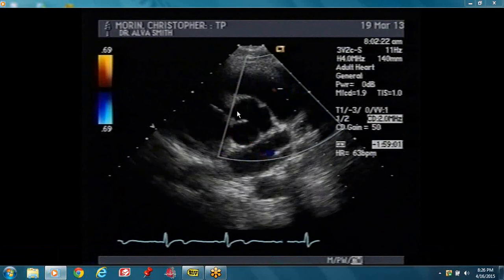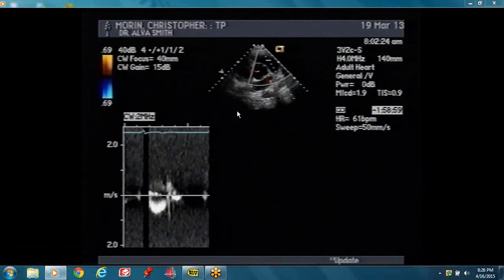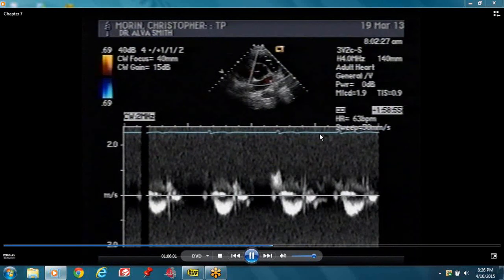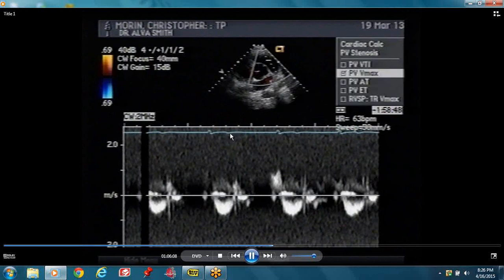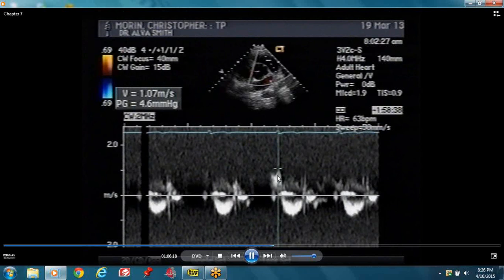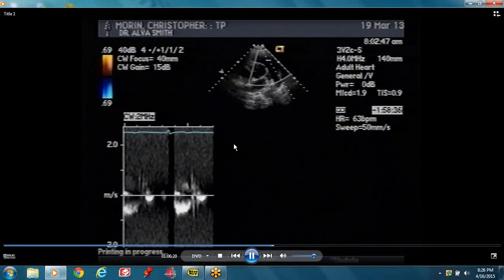You always put color across as well. It's a systolic flow because everything is gated to the EKG. Systole is from your QRS to the end of the T wave. There's a little PI which is measuring pulmonary insufficiency — it's a diastolic flow, very tiny.